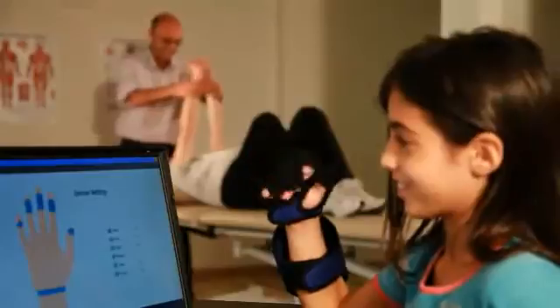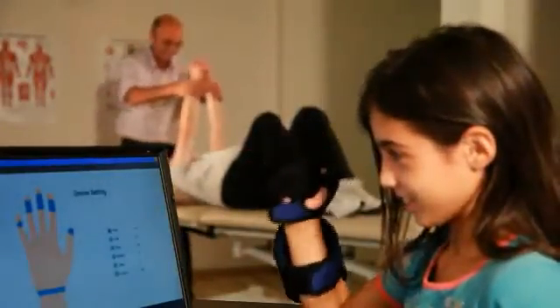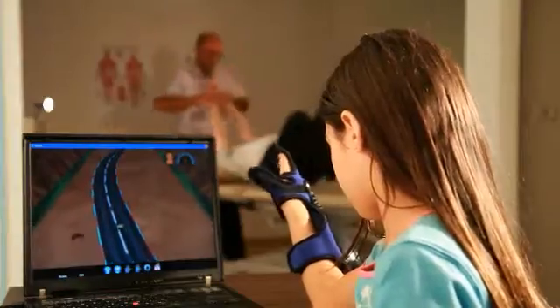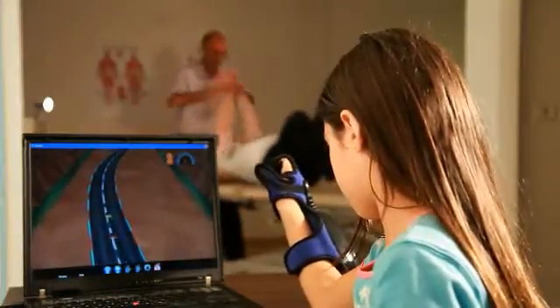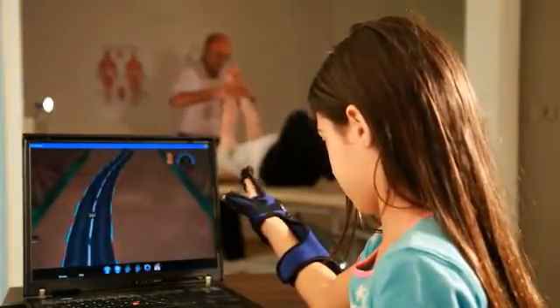The Hand Tutor system uses dedicated rehabilitation games in the form of challenging and motivating virtual functional tasks. The system provides quantitative documentation on the patient's rehabilitation program. The Hand Tutor is affordable and reliable, being used worldwide by occupational and physical therapists.